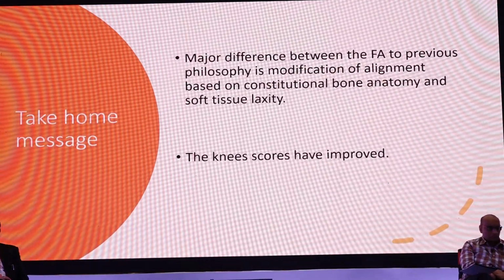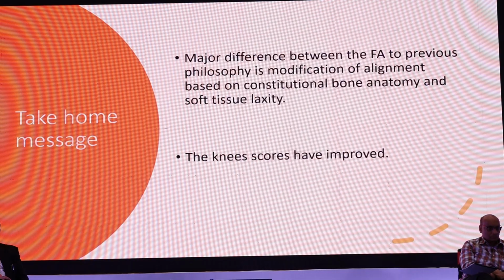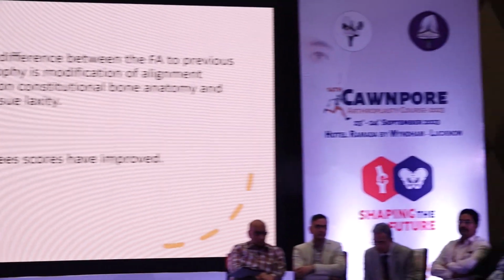Whereas when I see them at 3 months, all of them are saying the same thing that the non-robotic knees said: I've got some stiffness, some heaviness, some pain in the knee. So this is a true statement I'm giving you. But yes, in the early days, I can make a video and show them in 7 days without the stick.